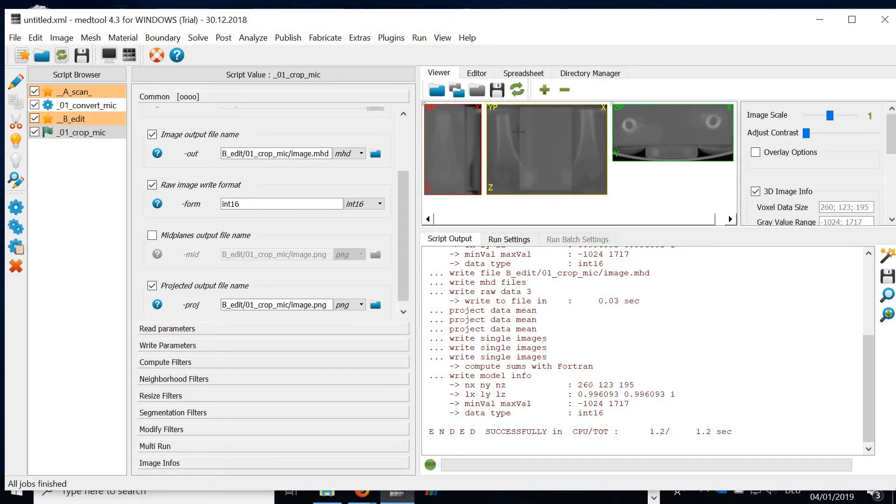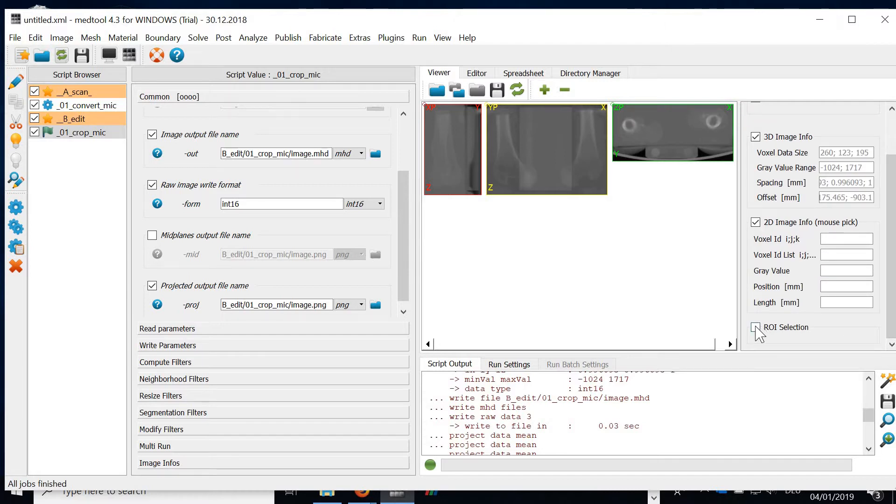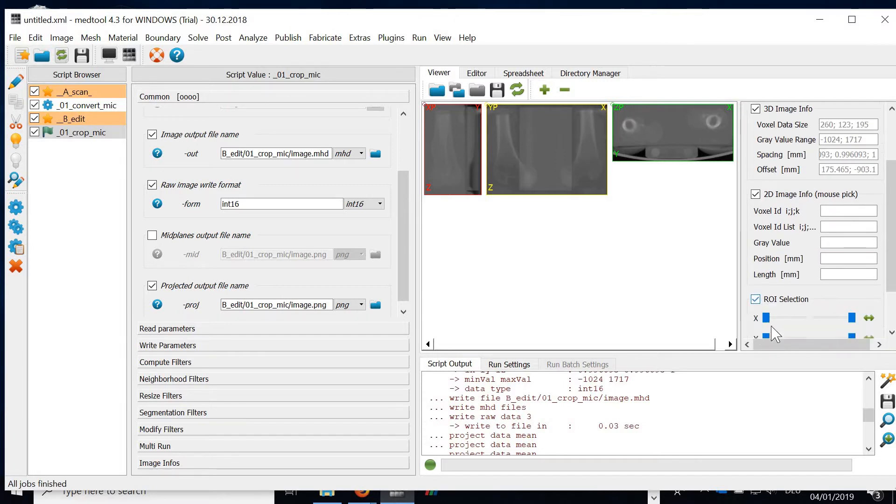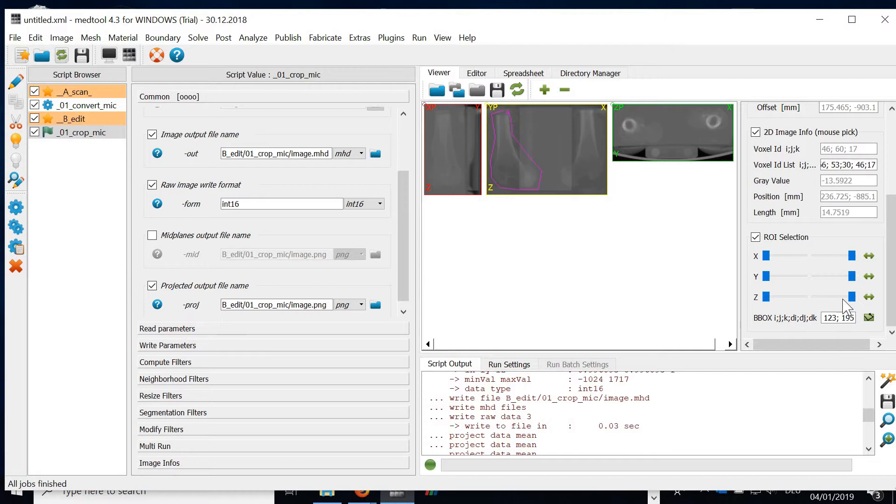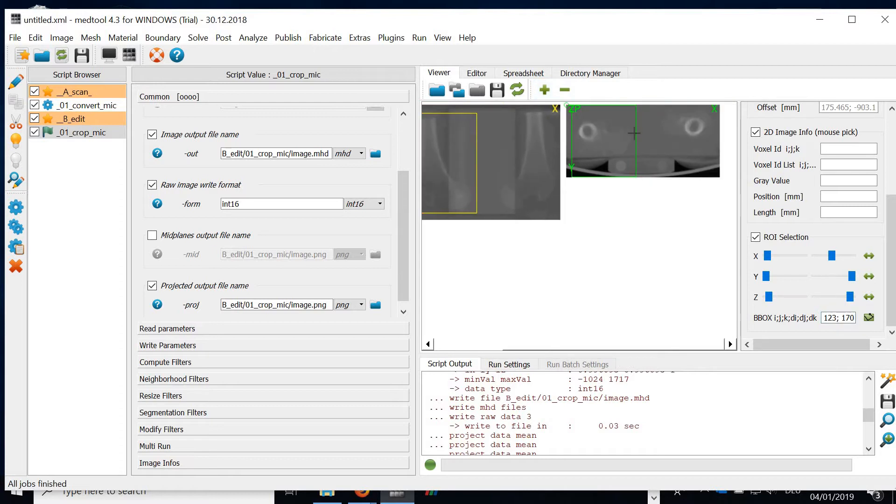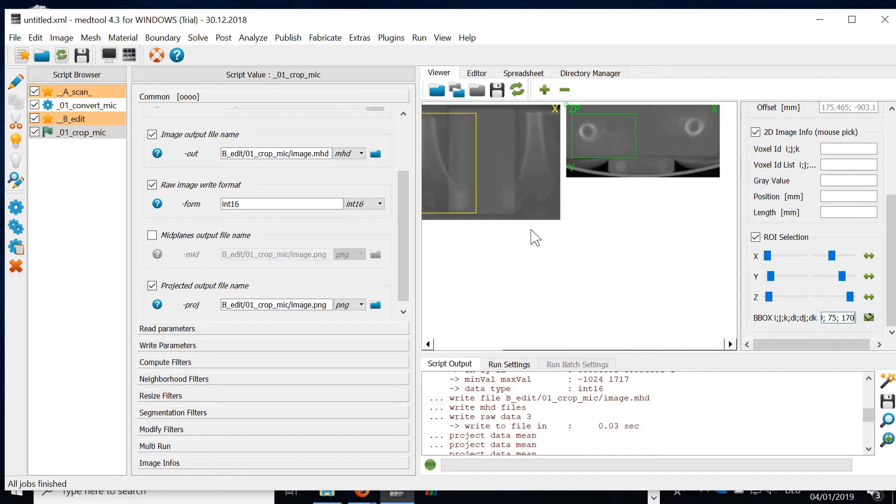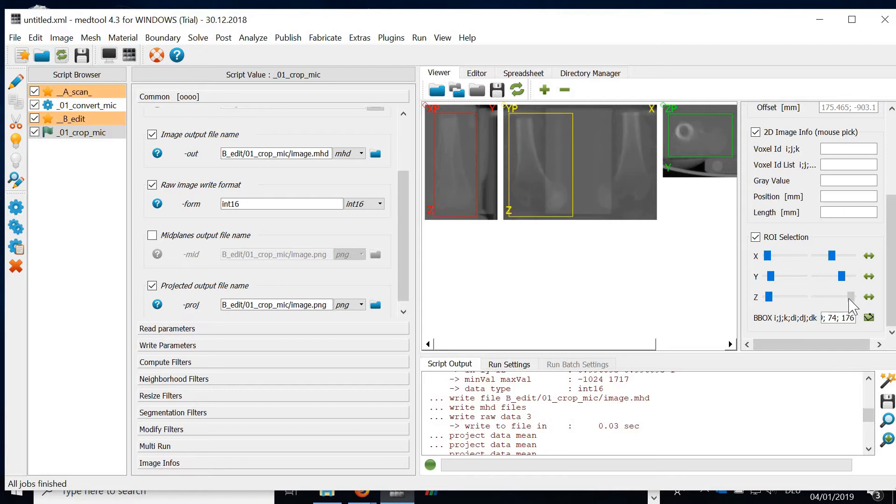And now we'd like to crop the images. For example, if you'd like to have this bone, how can this be done? There is a nice feature here. If you click here on ROI selection, you simply roughly click here around the femur, around this part you'd like to select. And then you click on this button here. So you see the bounding box is automatically selected. Here we see that the bone is still too big. So what you can do, you click on this part here again, roughly the bounding box, and again click this button. So the old ROI is recognized.